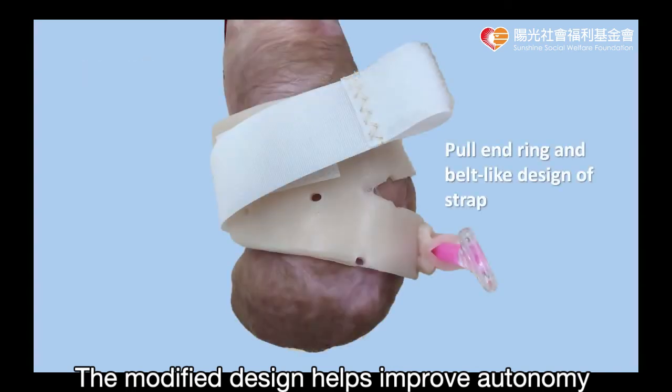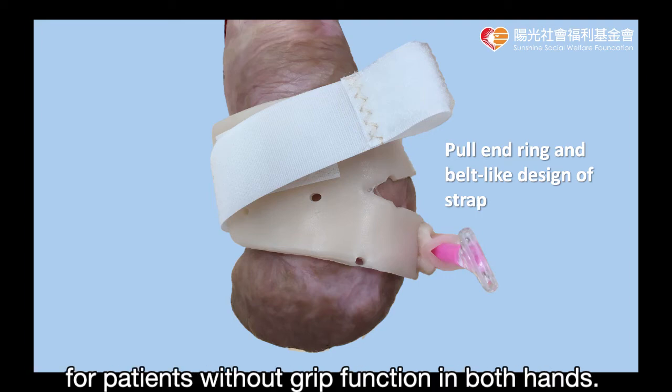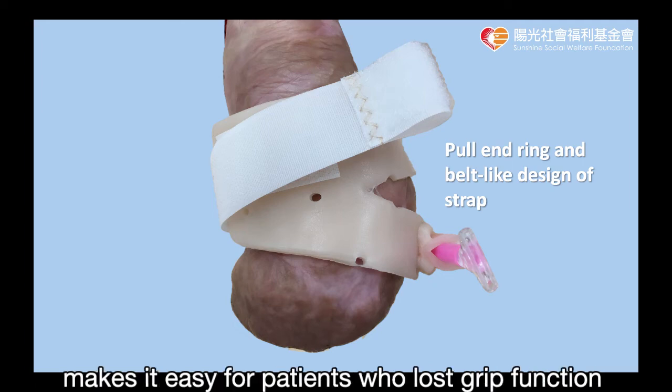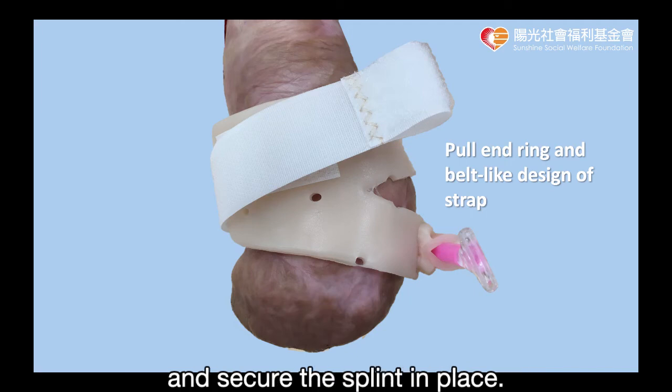The modified design helps improve autonomy and convenience of wearing assistive devices for patients without grip function in both hands. First, the pull ring end of the non-adhesive velcro loop makes it easy for patients who lost grip function of both hands to use their mouth to pull off the loop and secure the splint in place.